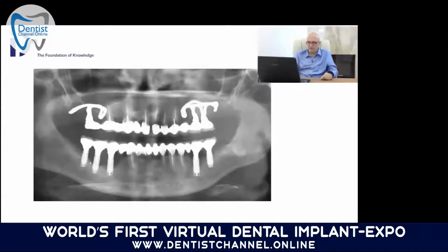Here you see bone loss down to here. Maybe only one third of the implant is still in the bone. The periimplantitis starts also here. So as you see, these implants are basically lost. This implant is on the way to being lost.